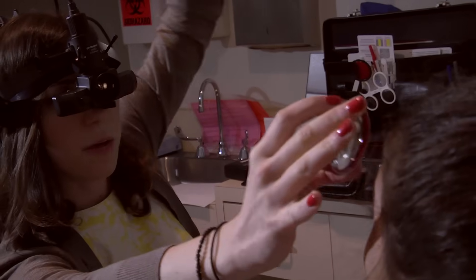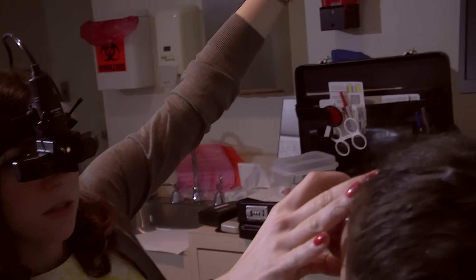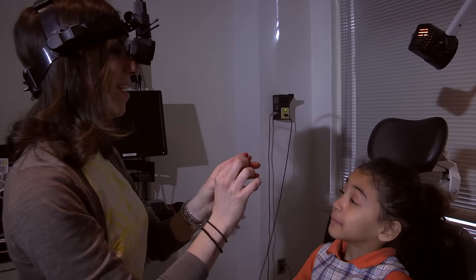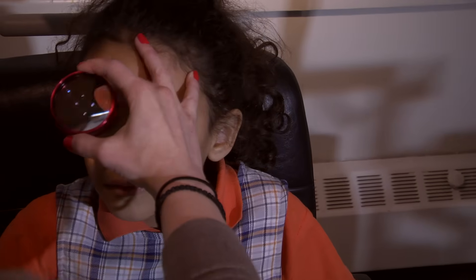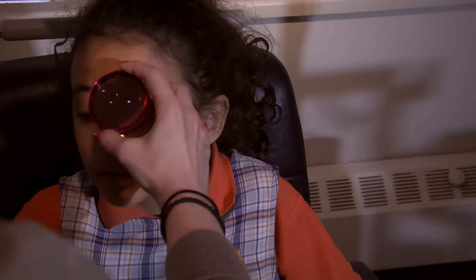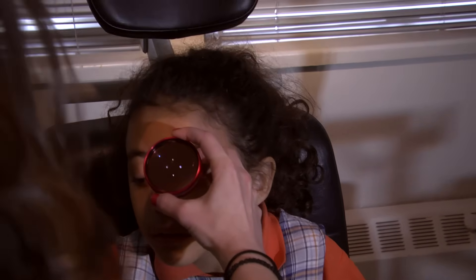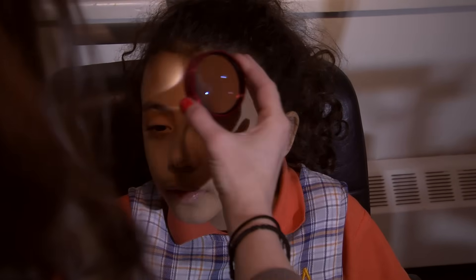Another test we do after the drops is called BIO. This looks like a helmet that the doctor puts on their head with a light in front. With this equipment, we can look at the back of the eyes, including the optic nerve, the blood vessels, the macula, and the rest of the neural tissue.